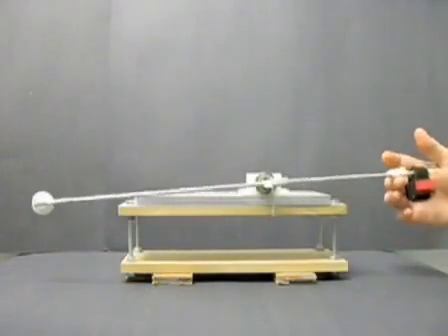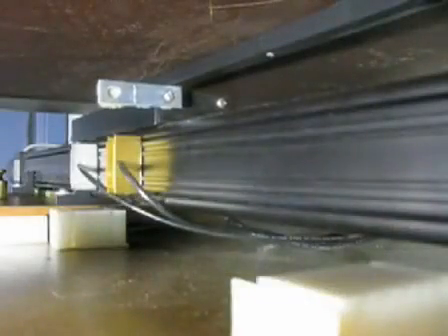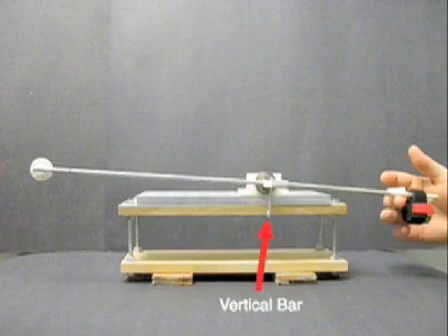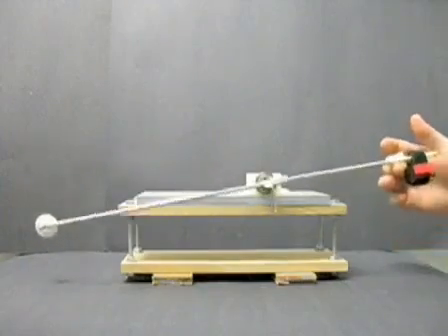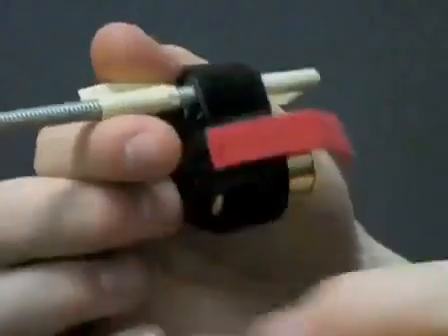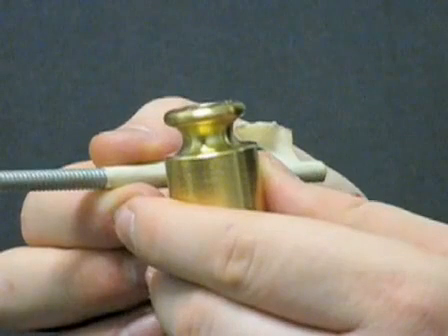With the pivot table in position and carefully aligned, the crossbar that extends from the actuator's carriage contacts a vertical bar that extends down from the rotating rod at the pivot point. A nearly frictionless metal bearing serves as the pivot point and allows the bar to freely rotate when the actuator's carriage moves forward. The mass is inserted into a Velcro basket which hangs from the rotating rod.